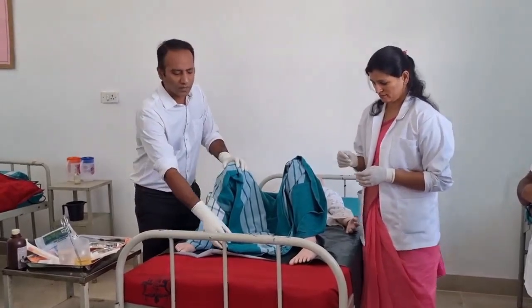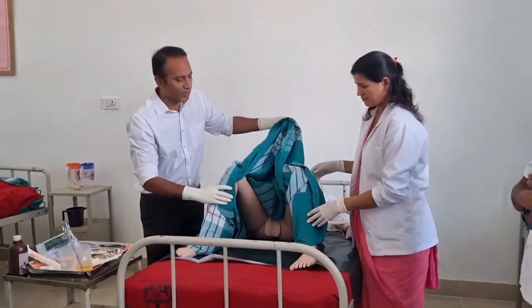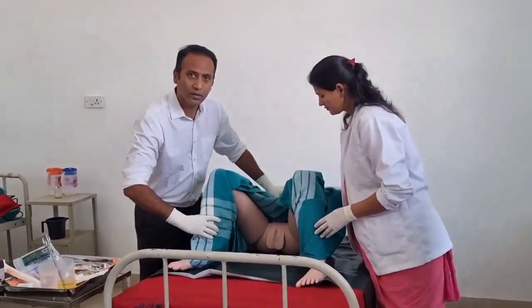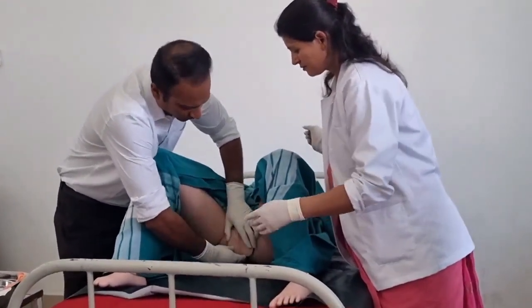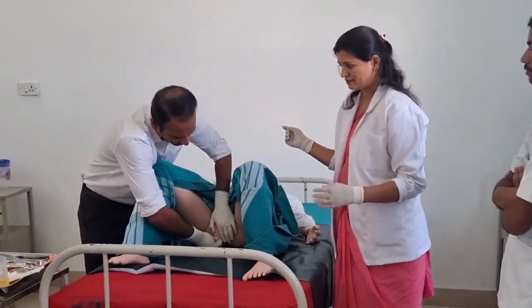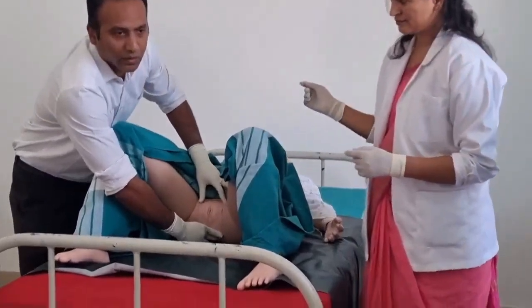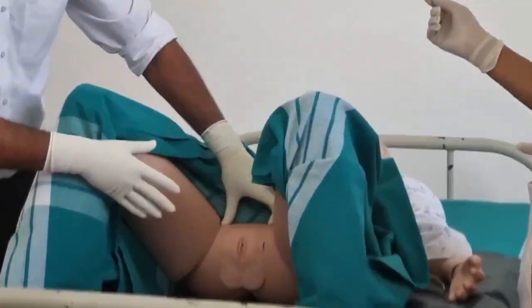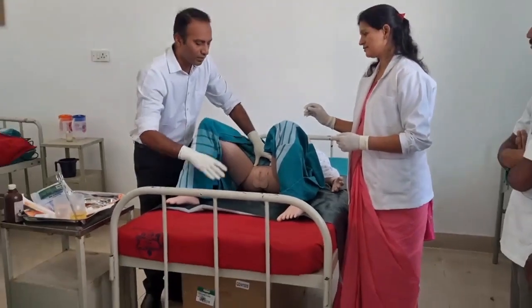If you lift it up, it will expose the genital area required for catheterization. This is a unisex dummy wherein we can replace the genitals, even for demonstrating male catheterization.